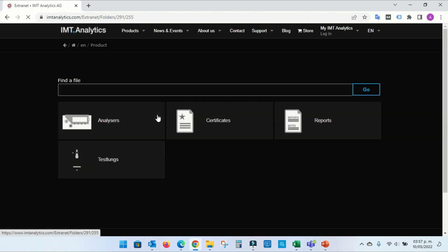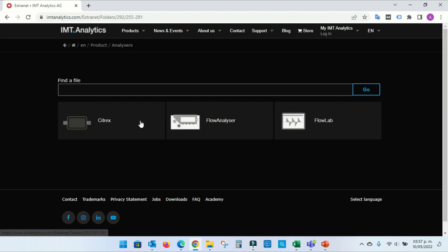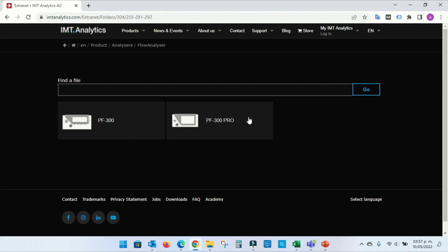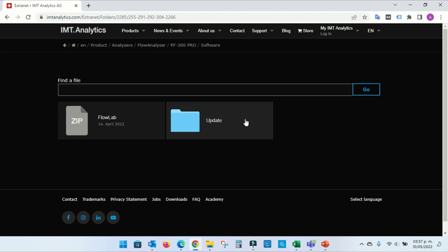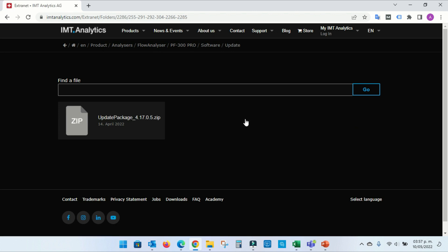Click Product, then click Analyzers. Click Flow Analyzer, then click PF300 Pro. Click Software, then click Update.